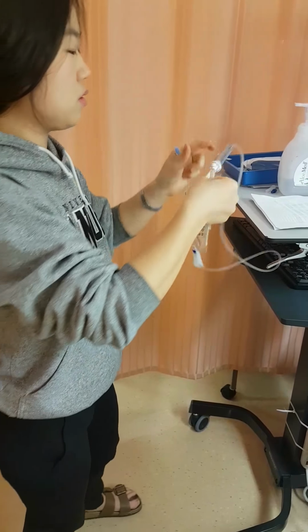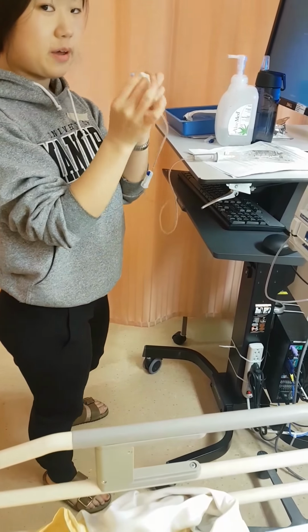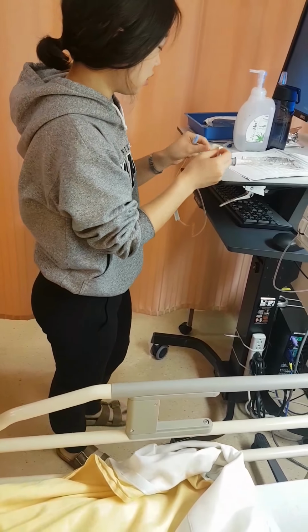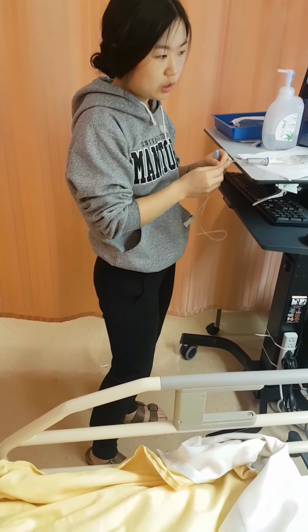Okay, so I've attached it. Before I forget, I'm going to add my label to the secondary line with my name, date, and time to let other nurses know who hooked this up and when.